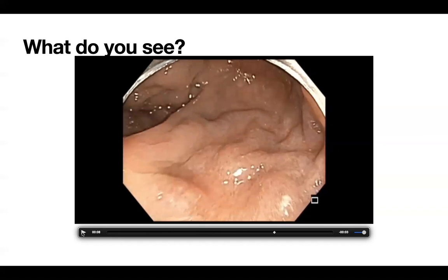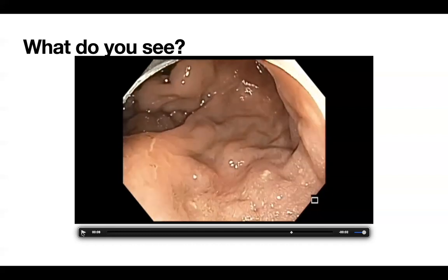Number two is that the CO2 insufflation is not adequate. Therefore, we cannot see enough where the border is and whether there is, like, a rectal, is it a rectal varices there? That looks like a snake on the other side. Right, right. I don't know what that is.